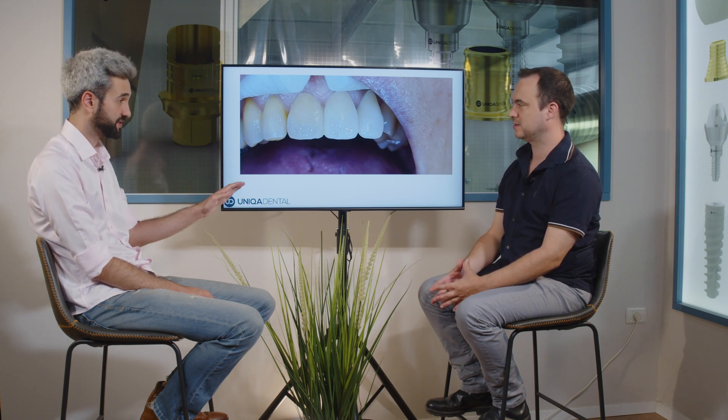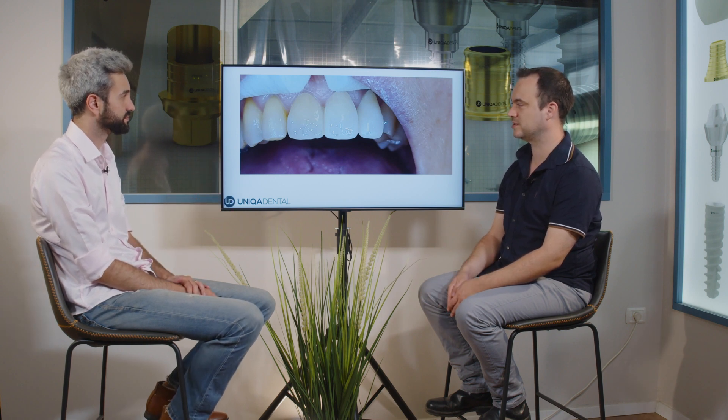This is the final restoration — it's a permanent zirconium. With the temporary restoration you don't add colors to it. I adjusted the anatomy a little bit. Did you make a new bridge? No, I adjusted the original one.